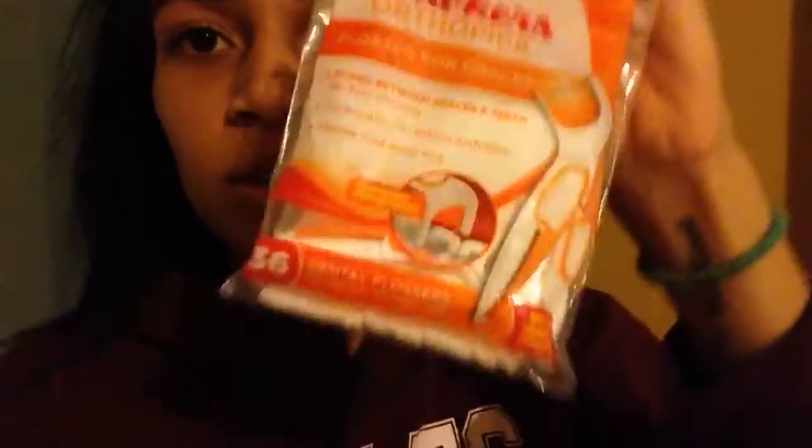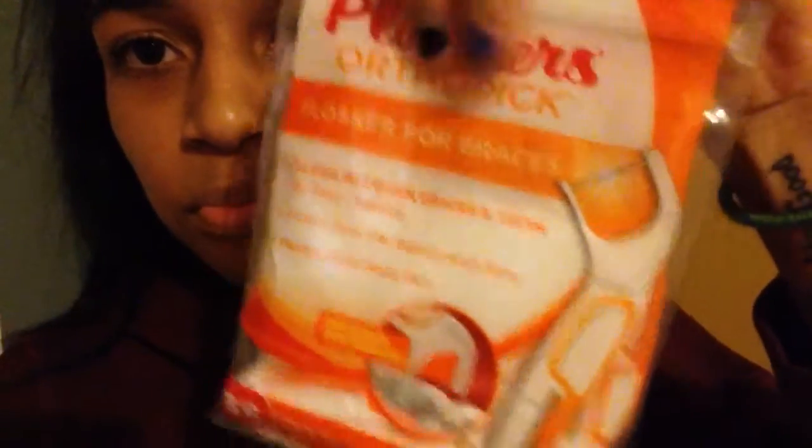I'm going to show you what not to do. I'm going to make a separate video when I get home because I'm not even in town right now, so this is why the video quality is bad. You don't want to use these — they're just the braces floss stuff, not normal floss. They get thinner, and this is what broke it.